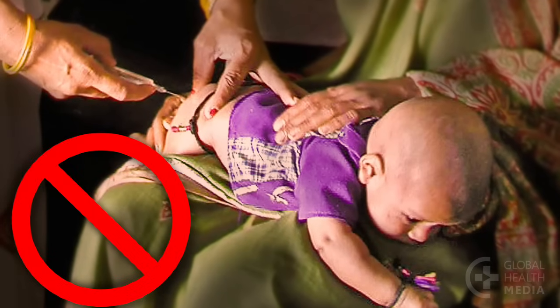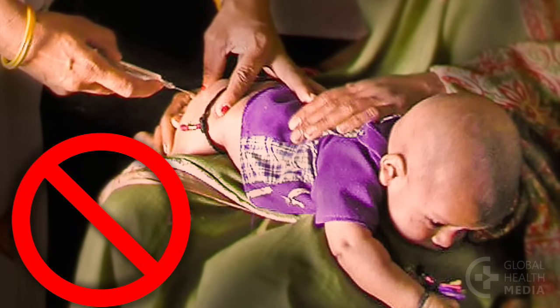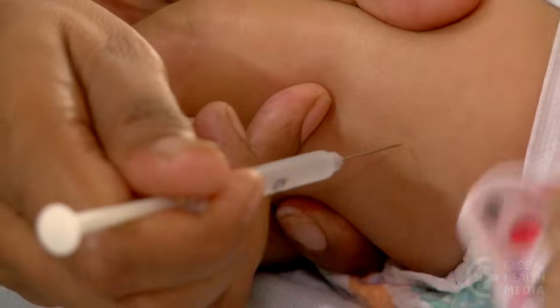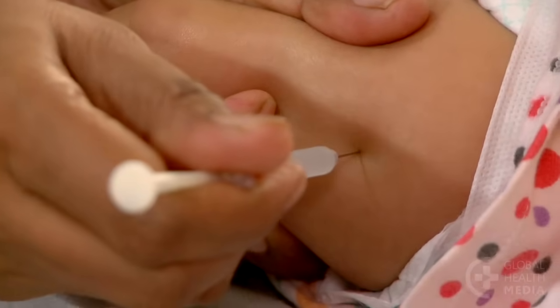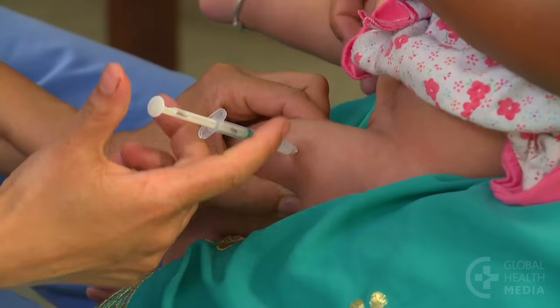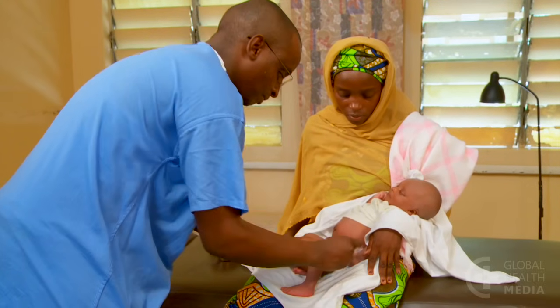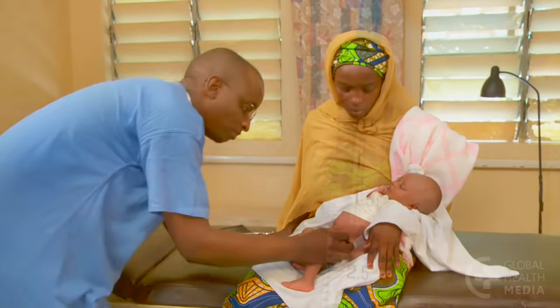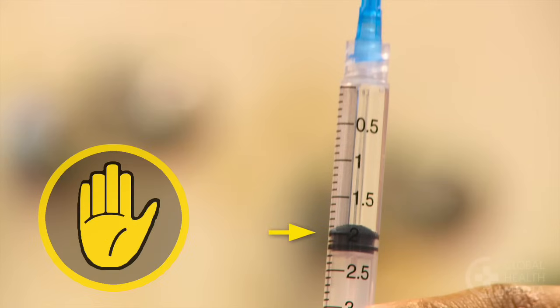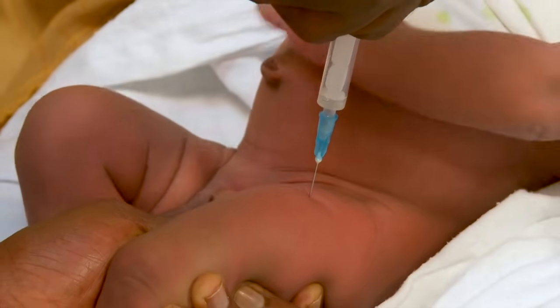Never inject into the buttocks of a baby, where large nerves and blood vessels are found. Pushing the needle slowly through the skin is not wrong, but if it is done with one quick movement it hurts less. To reduce the pain of an injection, don't inject more than two milliliters of medicine into a baby's muscle. If the dosage is more than two milliliters, divide the volume into two injections — one in each thigh.